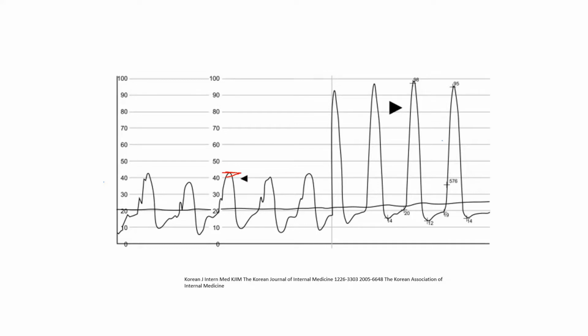And why does this happen? If you are negotiating the left main or stuff like that, sometimes you might get against the wall. You are not so coaxial. If you are against the wall, you are going to have ventricularization, because the pressure is going to be taken from the LV instead of from the artery.